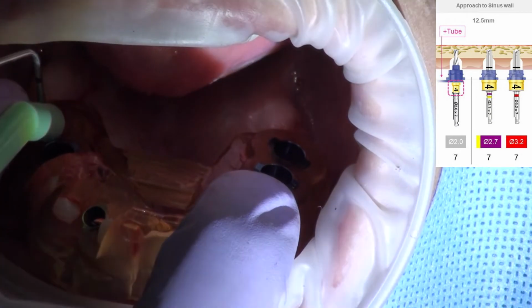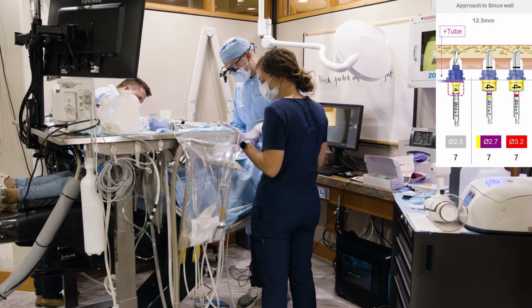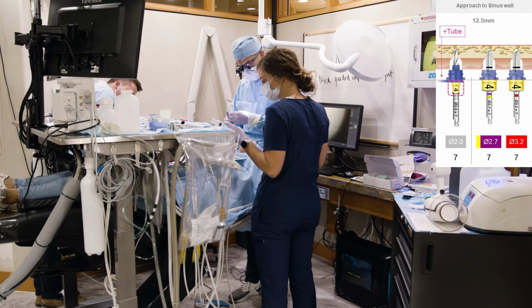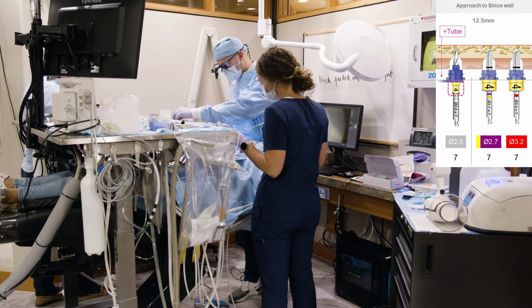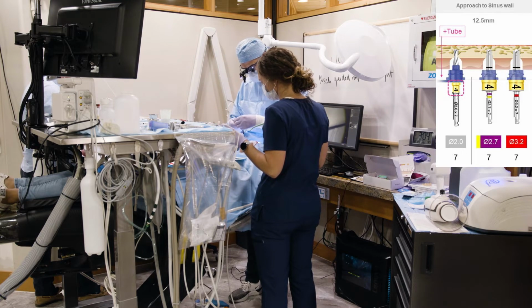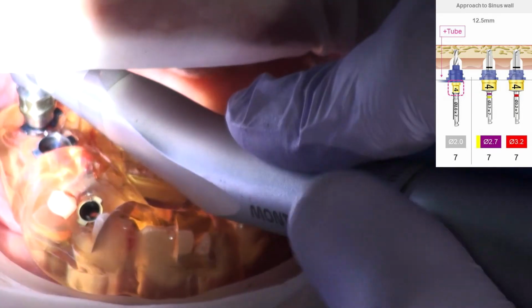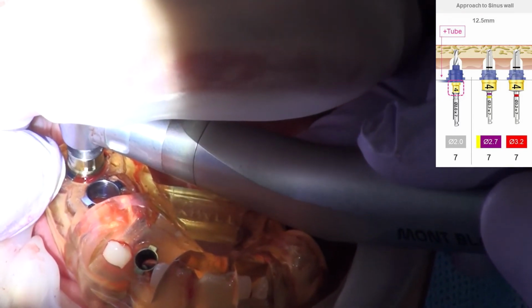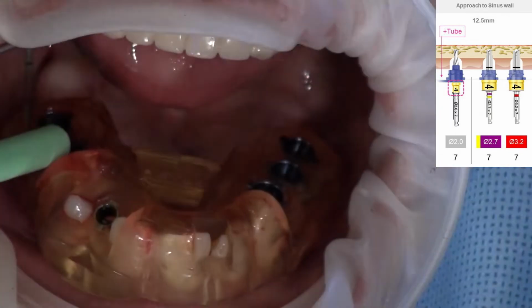And then my drilling protocol next is a 2-7x7 with the 4 stopper. So the drill tube comes out. I'm going to grab my 2-7x7 with the 4 stopper on the top right-hand side of your kit. There's my stopper. I'm going to line this up. All the way down, hard push, and out. Beautiful. Next is a 3-2x7.